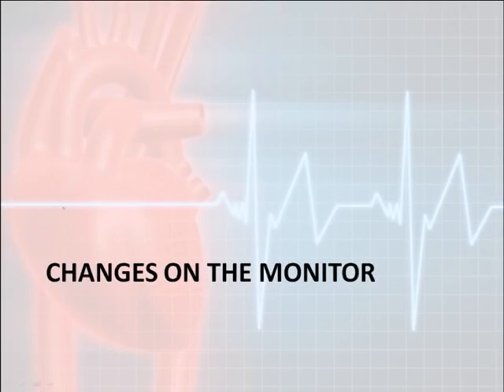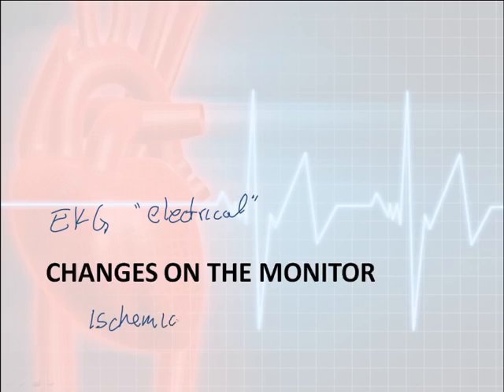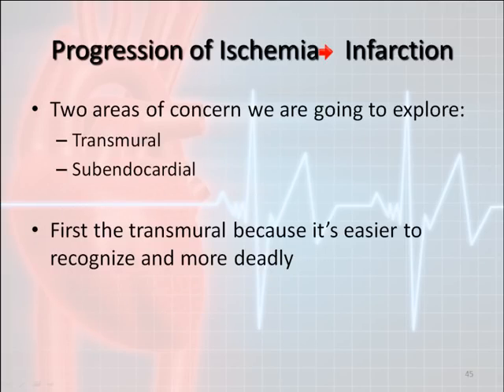In this presentation, we're going to cover the EKG changes, specifically the electrical changes that occur on the heart monitor, specifically with regards to ischemia and infarctions. What I'd like to do first is explain the progression of ischemia to infarction.